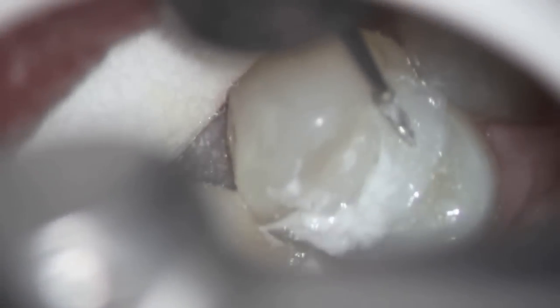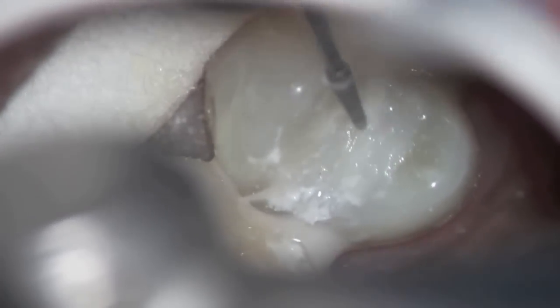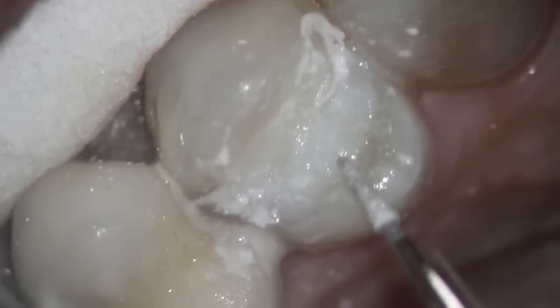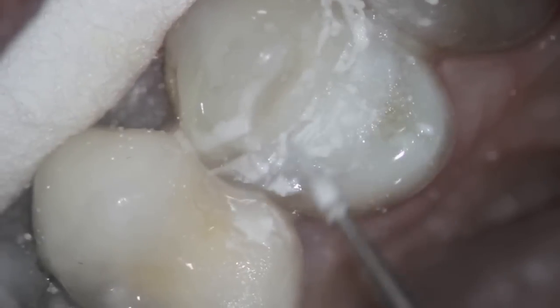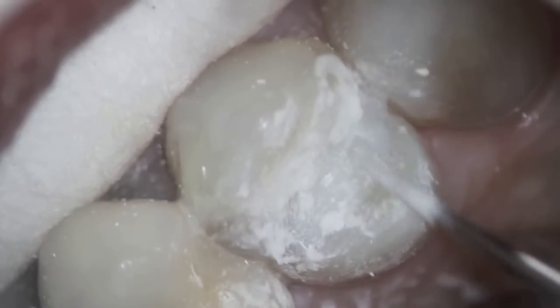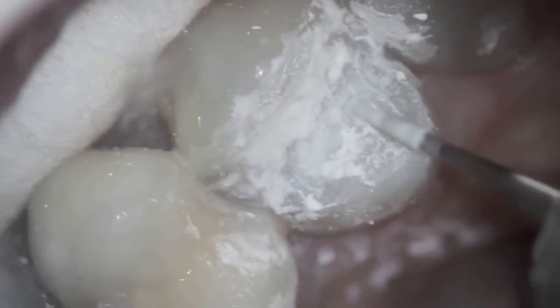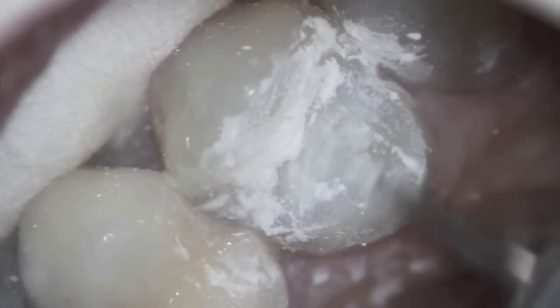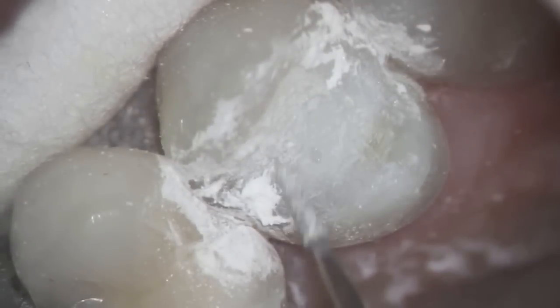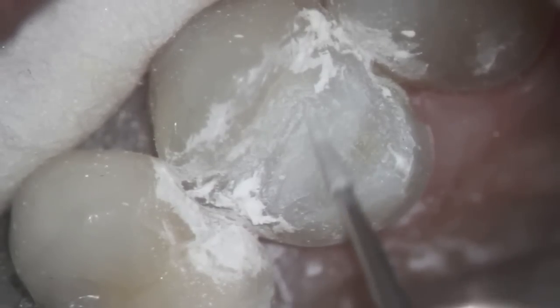But it is an excellent opportunity for a dentist who has a microscope to learn how to contour the filling and get a little more familiar with using the different positions, different magnifications, carving in the anatomy as they follow the contour of the tooth — being able to create what is in the mind's eye through their hands through magnification. And that ability will transfer to when you really need it, such as when removing decay or polishing down a margin for a crown.